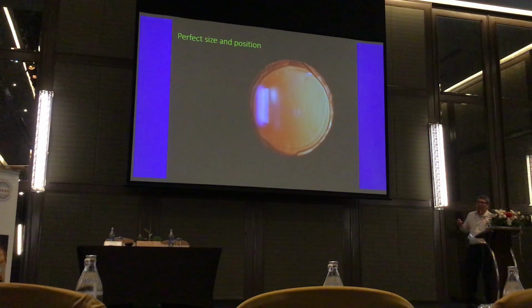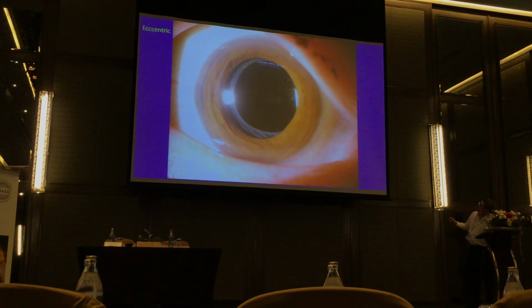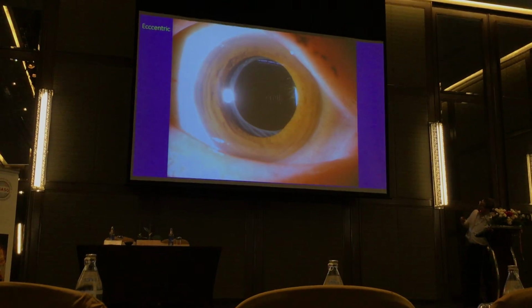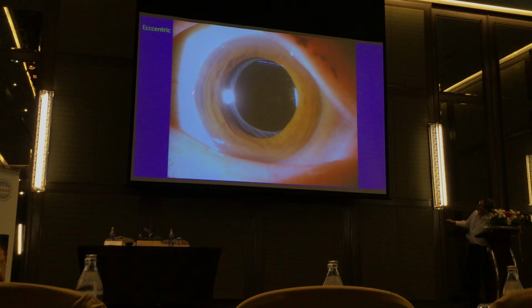Now we all like our capsulorhexis to look like that. Perfect 360-degree coverage of the rim of the IOL with a little bit. So this is probably a 5 to 5.5 mm well-centered CCC. But you also know that we don't always get that. Here's one of my own cases from many years ago, and my incision is always temporal. What do you see here? You see that I've got a very eccentric CCC, right? It's to one side, you always say, no big deal.